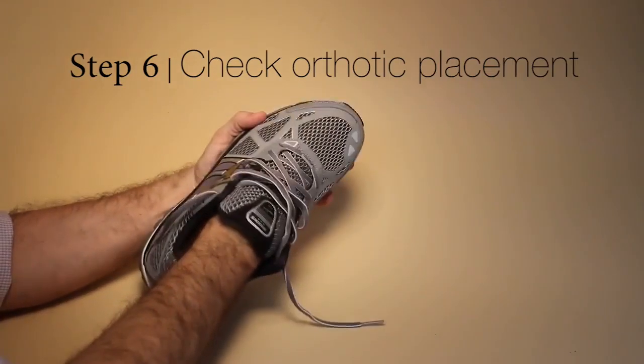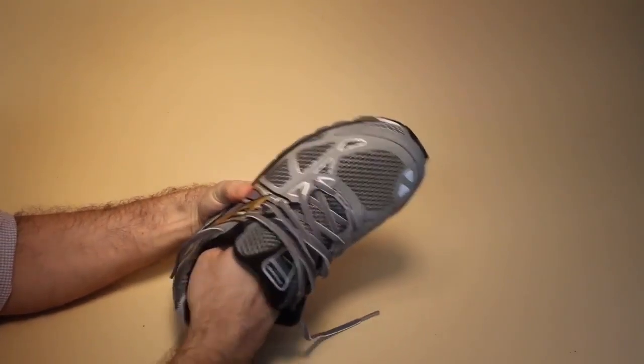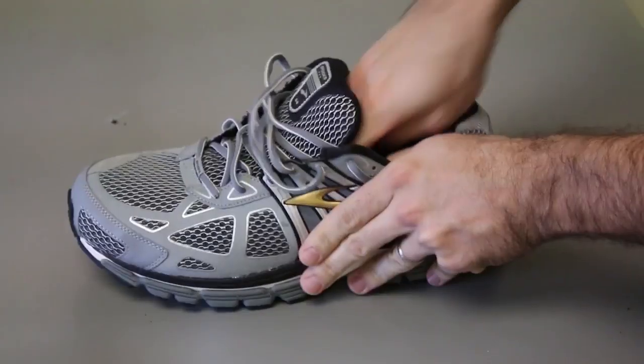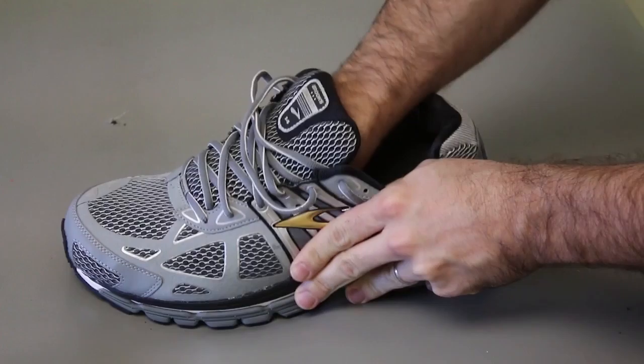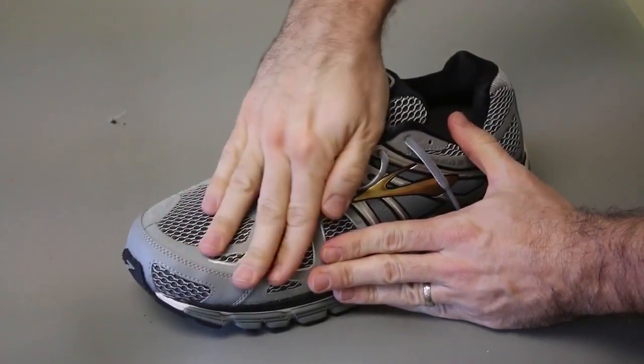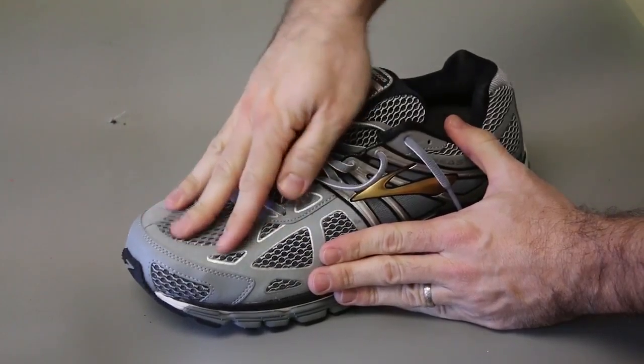Step 6. Check the placement of the orthotic. Once the heel is pushed down, place your hand into the forward section of the shoe to ensure that there is no folding of any of the orthotic material at the toe. Feel for parts of the orthotic curling up the sidewall of the shoe or gaps between the wall and the edge of the orthotic.